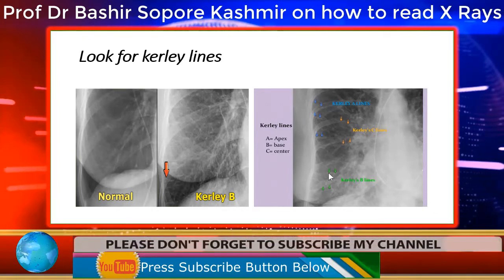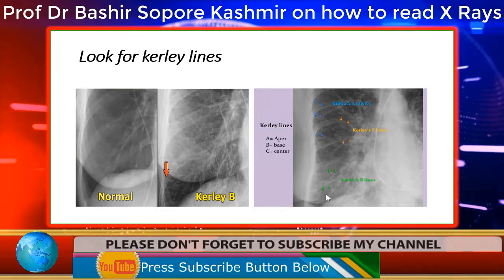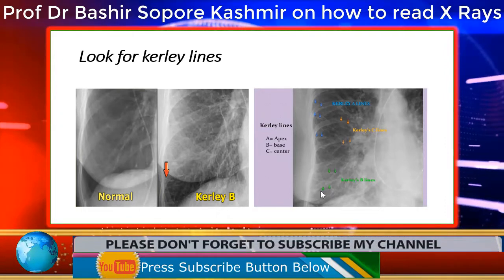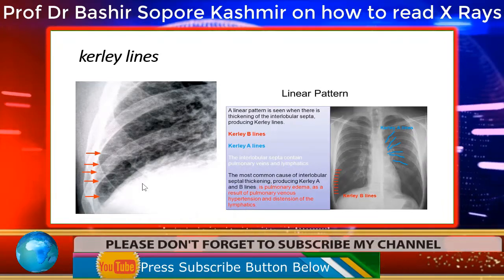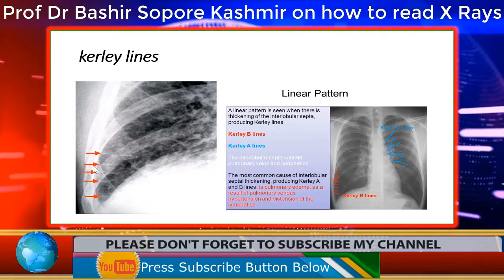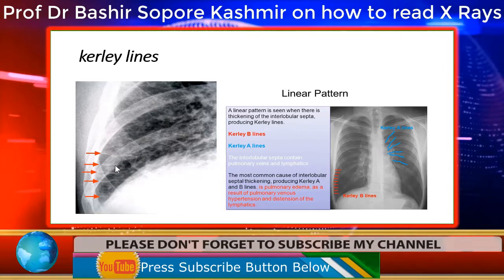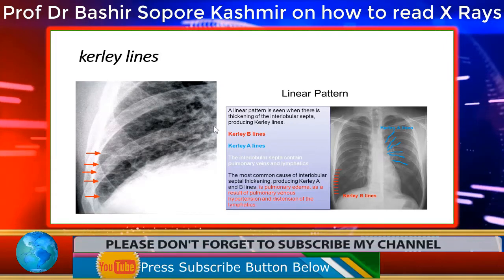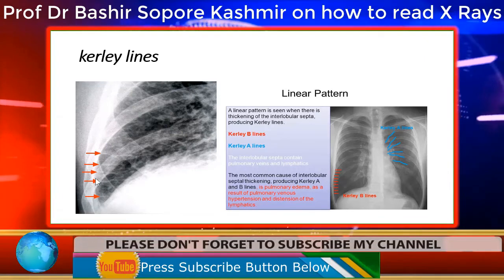You can see here this horizontal line which will be called a Kerley B line. You can see here also horizontal lines which can be called Kerley B lines. Here it is clearly seen, the horizontal line is like this, parallel lines to the lungs running a few centimeters from the periphery towards the center, and they are called Kerley B lines.